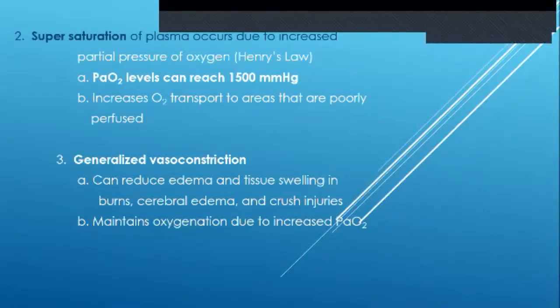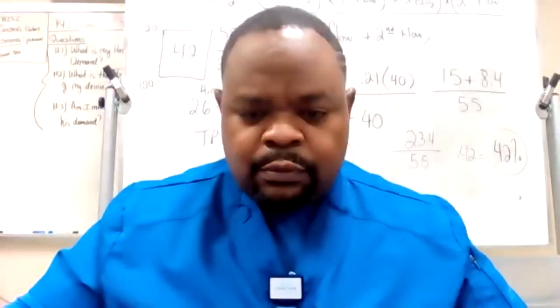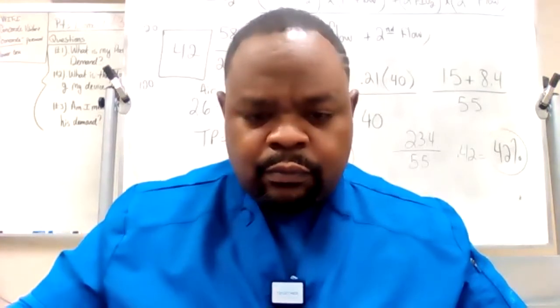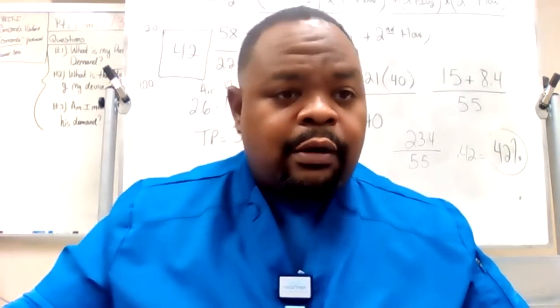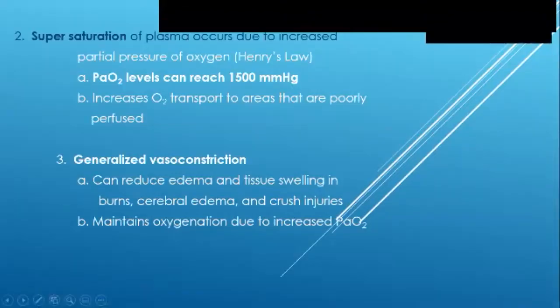So the main reason we use it is for supersaturation. Supersaturation. Let me get rid of some of this stuff off my screen. It's saying that it's too much going on. Hold that window. All right. Here, okay. All right. Supersaturation of the PaO2.